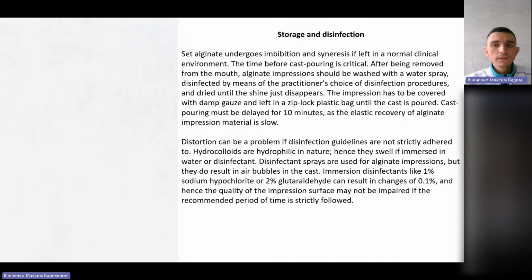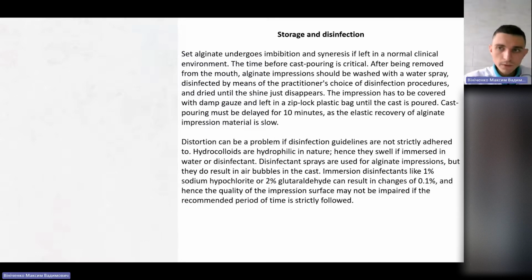So when we disinfect our alginate impressions, in Ukraine we do not use this spray. We have a special container with the disinfectants, and we put these trays in this container.